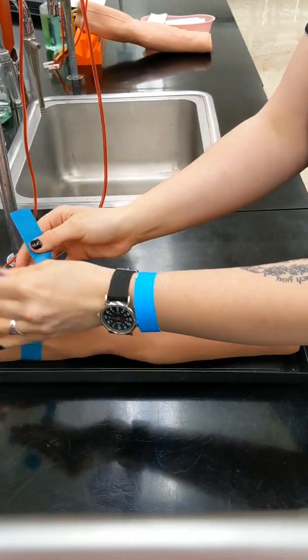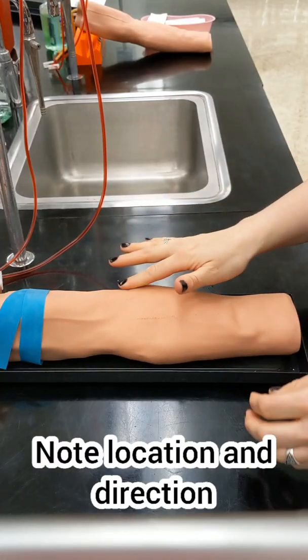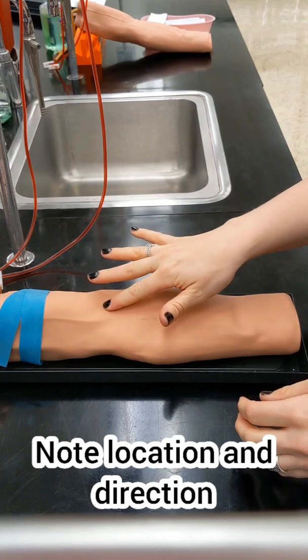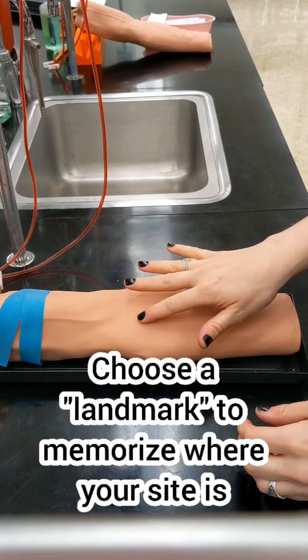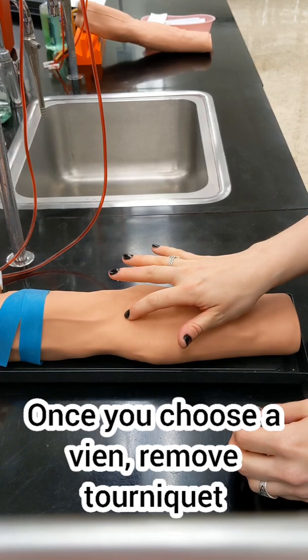The other veins are good options as well — they're just going to be a little bit more fragile and a little bit harder to pin down. Once you have a vein chosen, look at where it is going, its direction. Not all veins go up and down. Look at how deep it is, and choose a landmark like a freckle or a skin tag so you remember where that is.